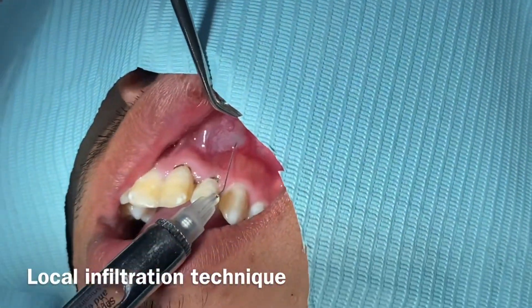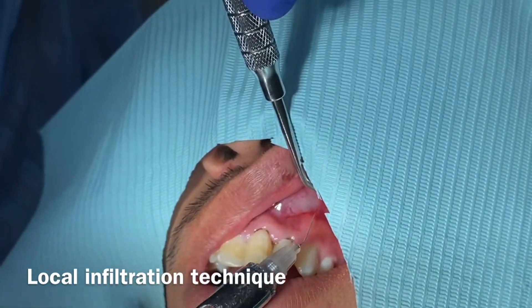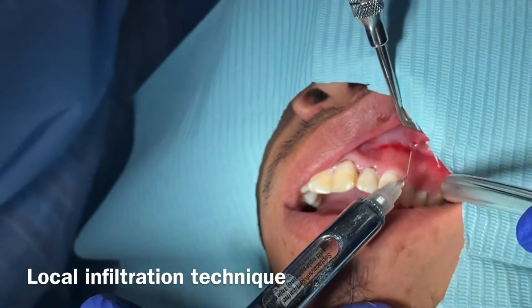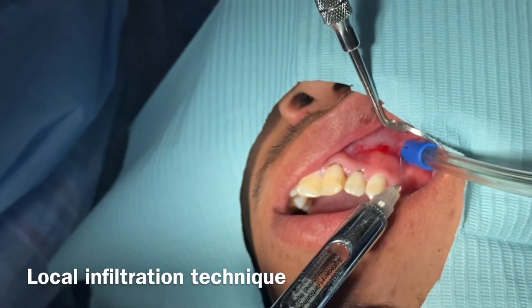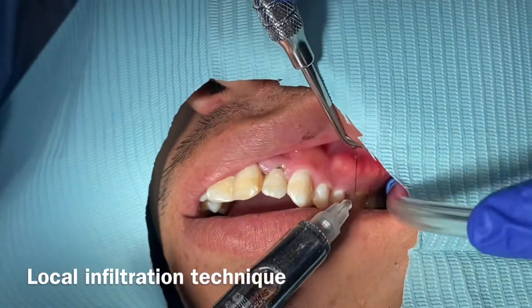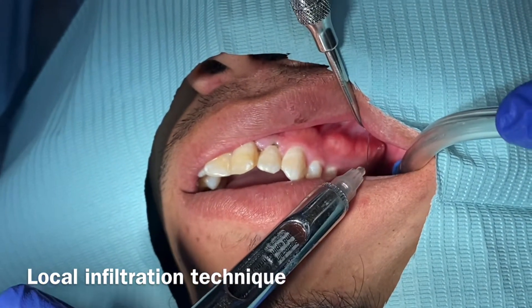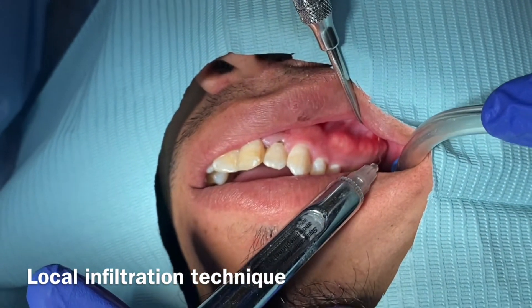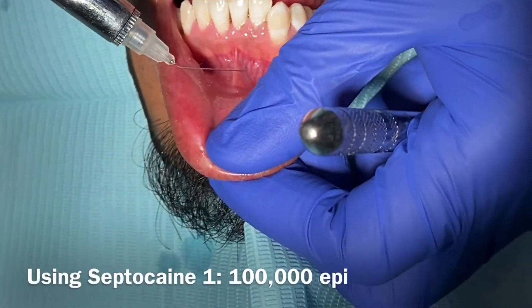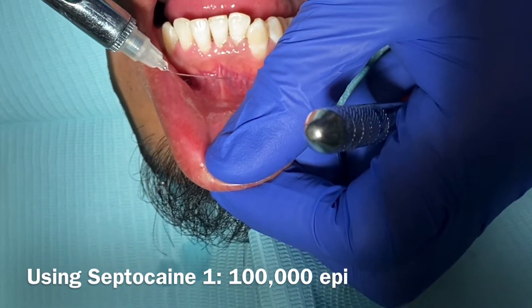In this particular video I'm doing a deep cleaning using a walk-in technique — a local infiltration one spot at a time right at the apex, which is the bottom of the root area, for each tooth. I'm infiltrating using Septocaine so I can numb the patient one tube at a time, instead of doing the block — numbing at the nerve bundle — which numbs the whole entire jaw, like the inferior alveolar nerve (IA) technique. Or I can do infiltration on each tooth.